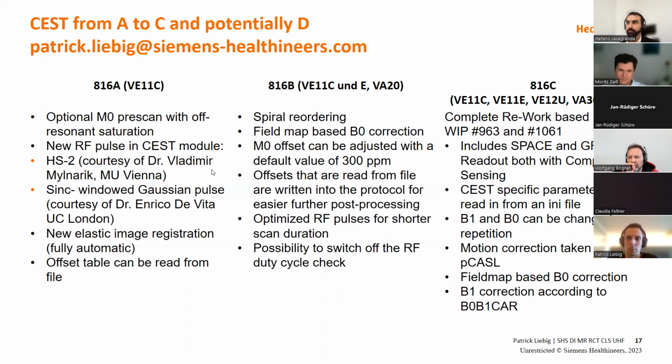This is where we compared it also to the slab selected one. You can also look it up in the paper from Maria. Here we really compared it to the subset with an acceleration factor of 2, and these were consistent.